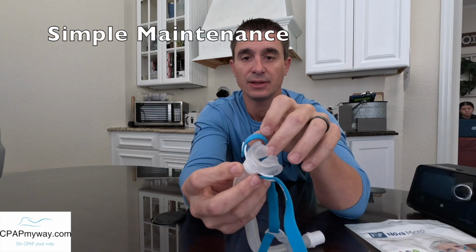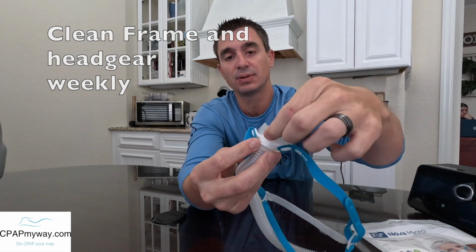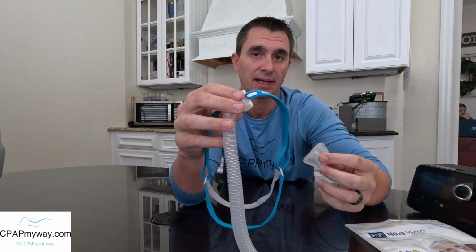That is all there is to it, right? You got to do the cushion once a week. You got to do the frame and the headgear. I'm sorry. You got to do the cushion daily. You got to do the frame and the headgear once a week. So really, all you got to do is peel this off daily, wash it real quickly, let it air dry, and then weekly take the whole kit and caboodle, soap and water, let it soak just for a short period of time, rinse it out real good, and it's all good to go.